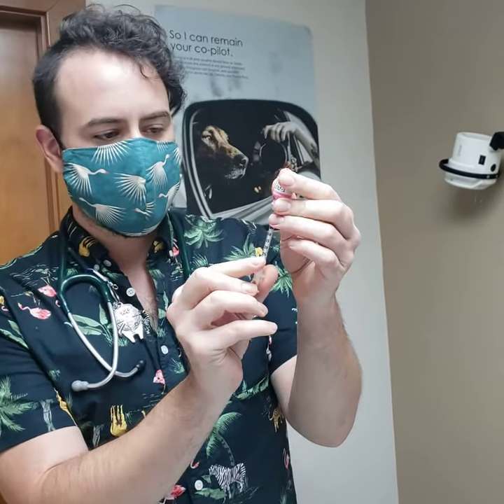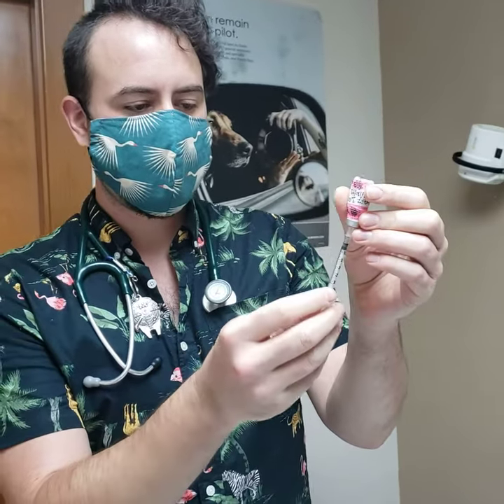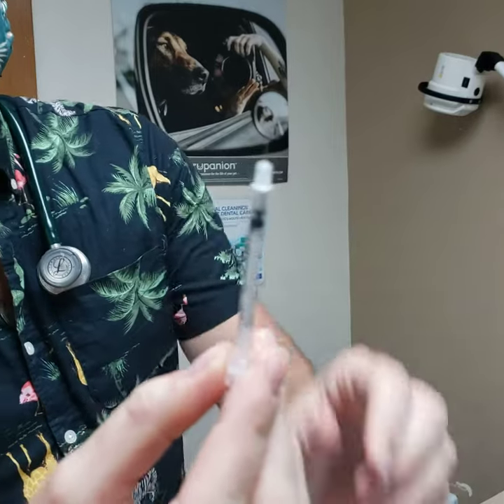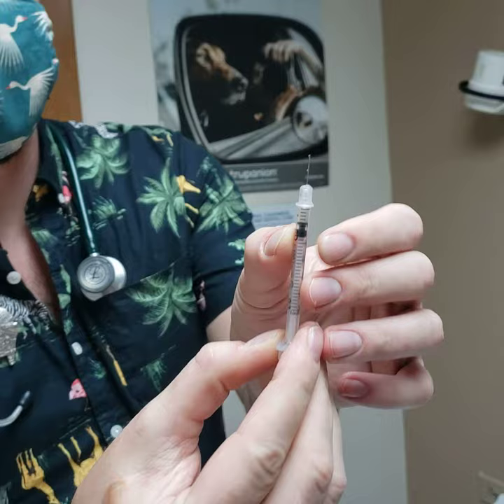So what we're going to use is our syringe. We remove the cap and we have the needle. We'll introduce the needle into the rubber hub. We are drawing up 0.04, or four one-hundredths of a milliliter, which goes to the fourth spot on the syringe, right above the five.